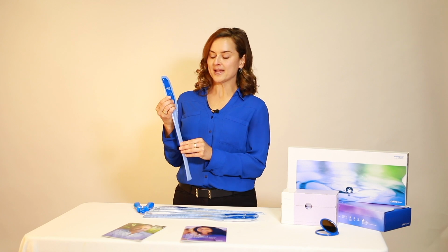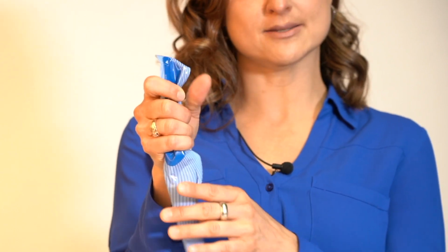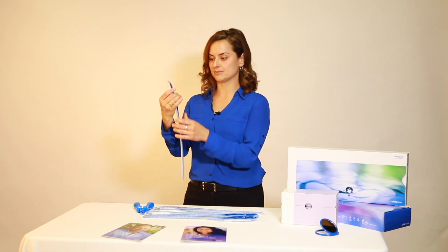I'm going to demonstrate a few different ways on how to release the sachet, which will then instantly activate or lubricate the catheter. The first way I'd like to show you is by simply following the directions on the label of the LoFric Origo package, and you wrap your hand around the catheter, give a gentle squeeze, and then you'll hear the sachet release or feel it release, and the salt solution fills the chamber that the catheter is sitting in, and it's instantly activated and ready to use.